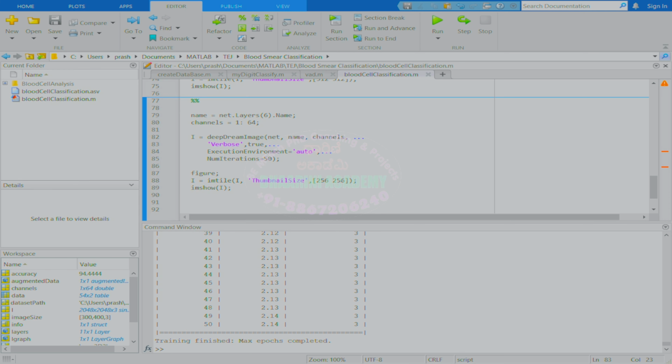This is something like a blood cell. This is another type. The various colors, etc. We can see the plain color over here, etc. So visualization is also pretty important whenever we are going to implement something using this kind of technique.